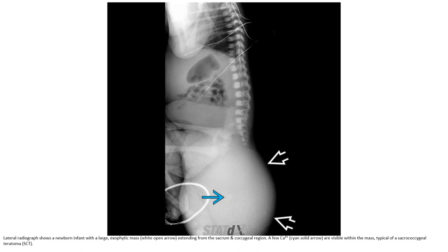This is a lateral radiogram of a newborn infant with a large posterior fetal mass extending from the sacral and coccygeal region. A few calcifications are visible within the mass, typical of sacrococcygeal teratoma.